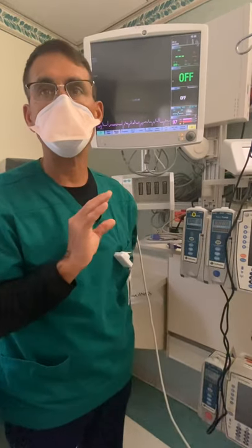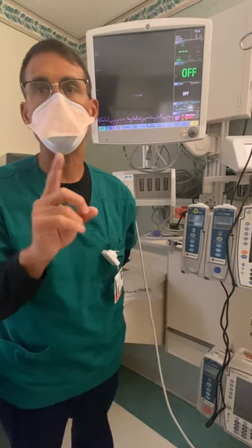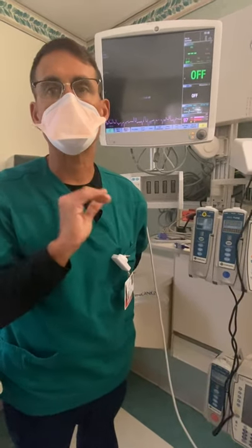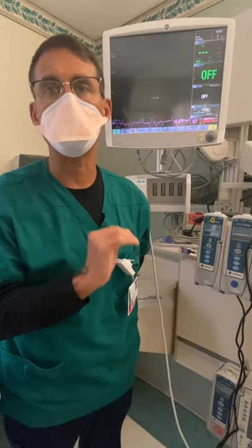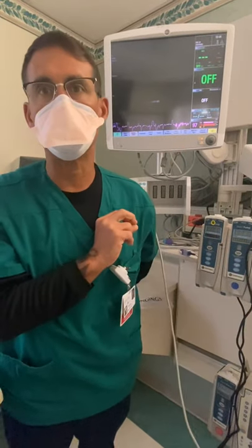Every single patient that we hooked up yesterday was right around 42, 45. One patient was a little bit too much, around 32. Everybody else was right where they needed to be. So please don't turn off sedation or wean down sedation on paralyzed patients unless you have a BIS monitor telling you that you have to do that.